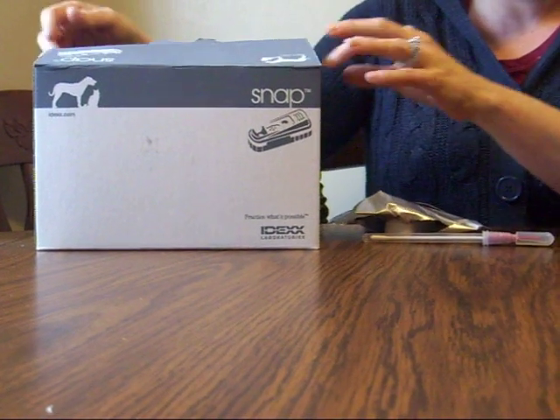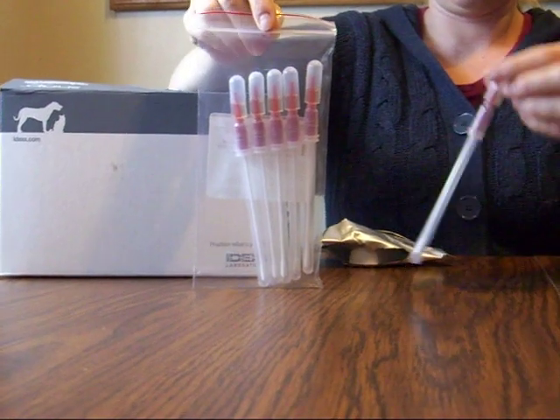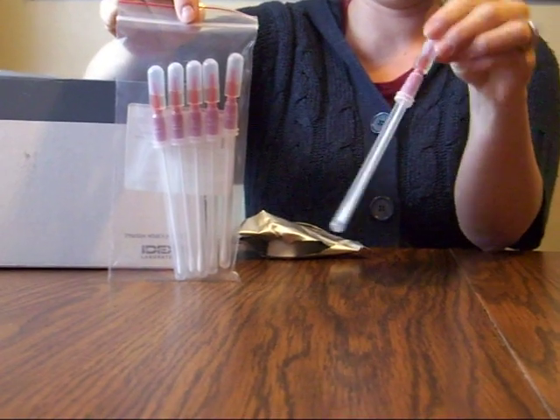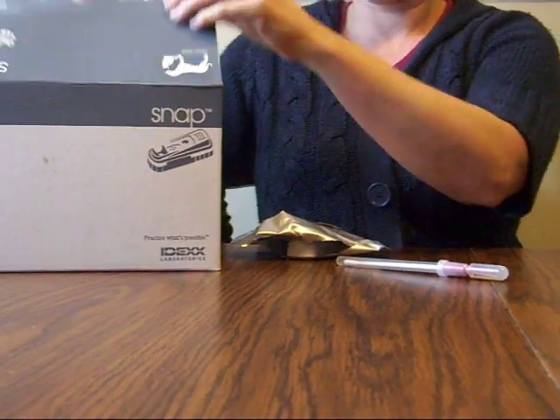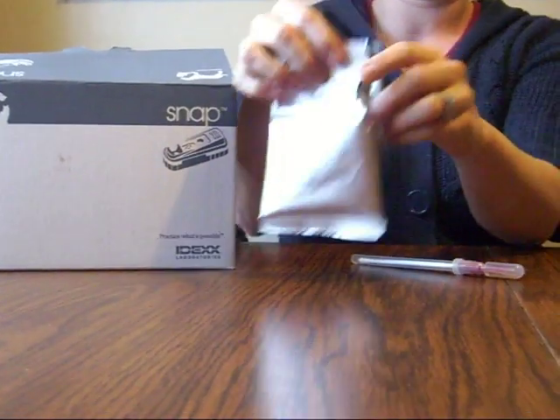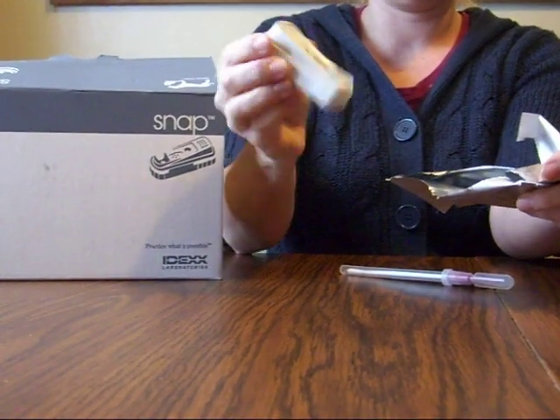When you open the box, there will be packets that look like this. There are about five or six of these in each one. And then there will be silver pouches like this. You tear them open, and inside is your Giardia snap test.